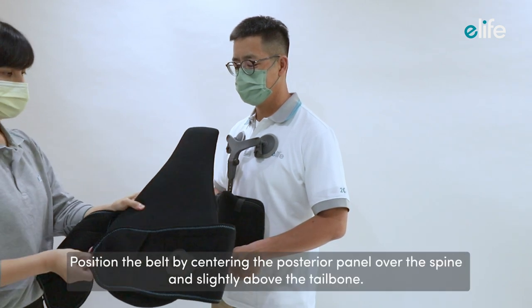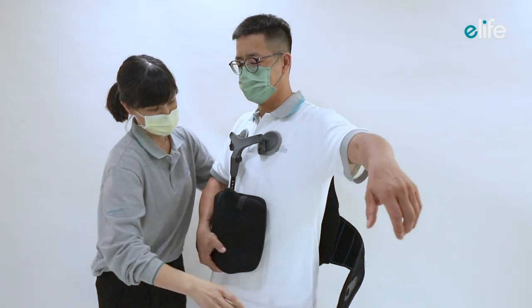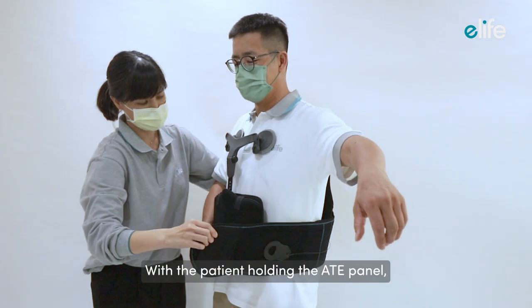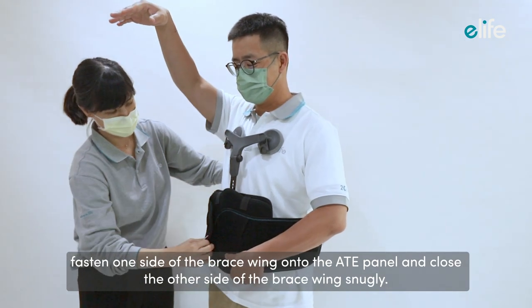Position the belt by centering the posterior panel over the spine and slightly above the tailbone. With the patient holding the ATE panel, fasten one side of the brace wing onto the ATE panel.